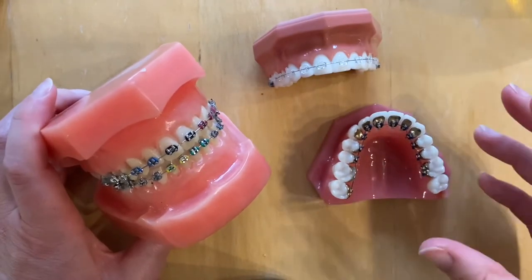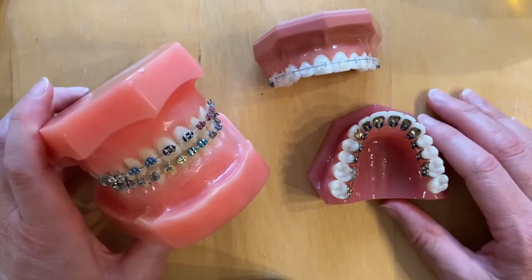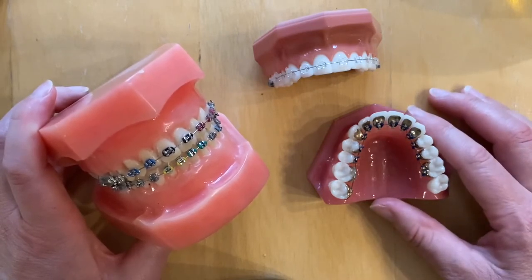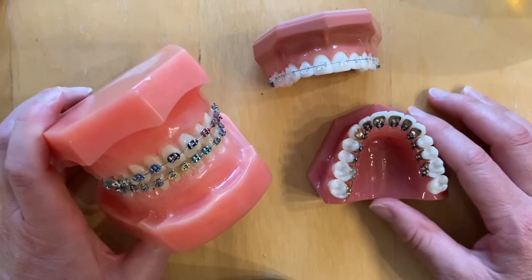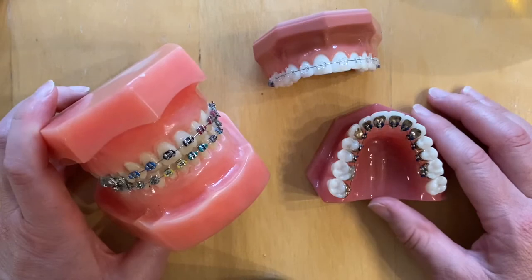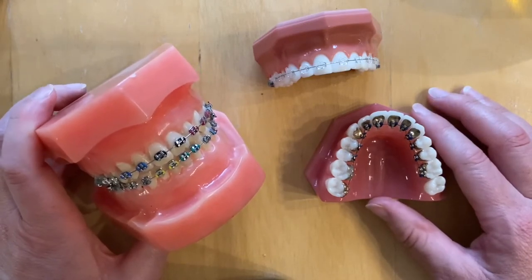The first thing you will feel is that it will feel quite uncomfortable and quite weird, but generally speaking the teeth don't start to hurt until about five or six hours after they've been fitted. At this point the teeth can get quite sore and achy, and a good idea is to take some painkillers - the type you might take for a headache. It will naturally get better over a few days, but it might take one to two weeks to really get used to the feeling of wearing your braces.